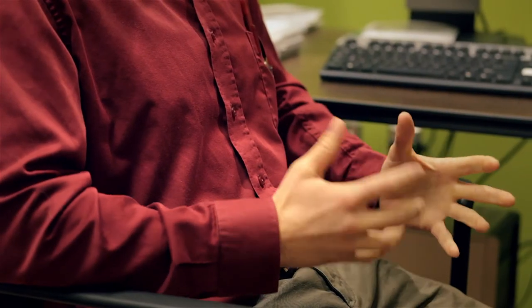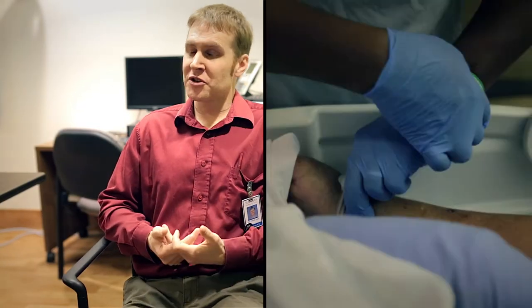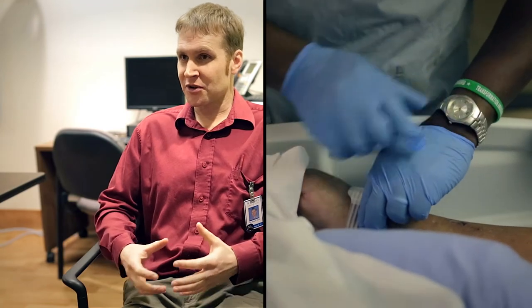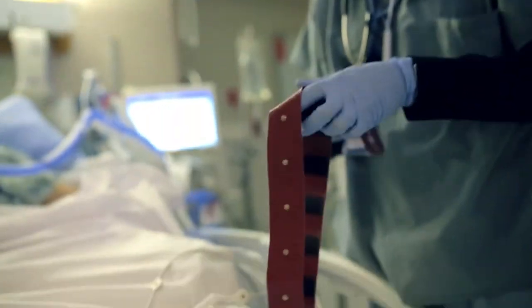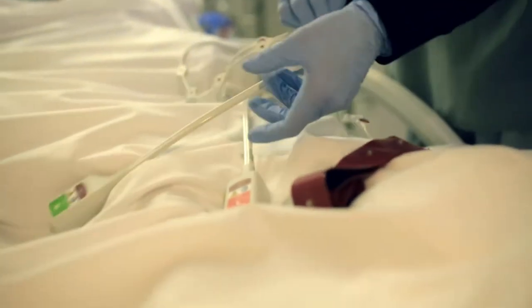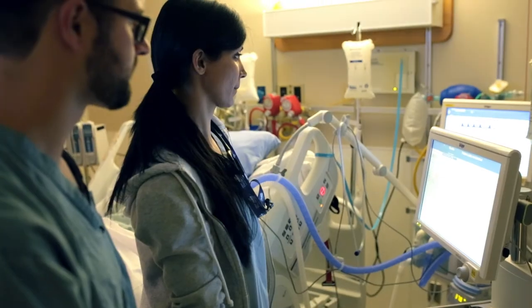The main cause of being in the ICU is still respiratory failure. So it is interesting that with respiratory failure we have some degree of monitoring. We can monitor oxygen saturation, blood gases, changes in the pressure on the ventilator and how different changes affect the flow and gas exchange of the patient.